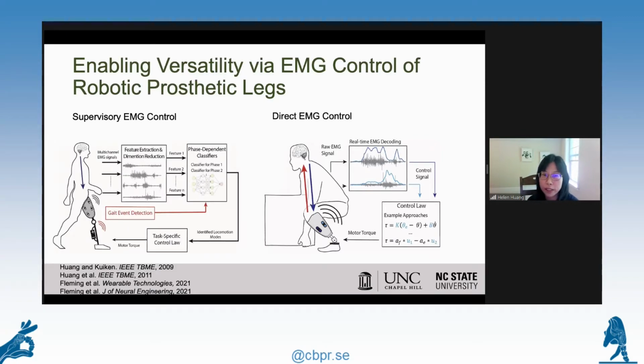So this autonomous control has a lot of benefits, but you also see the limitations. I think maybe including neural control would be an answer that can potentially further advance these robotic devices' function through a connection with the human nervous system. Specifically, what I'm working on is using the neuromuscular signal, EMG, collected directly from the residual limb.